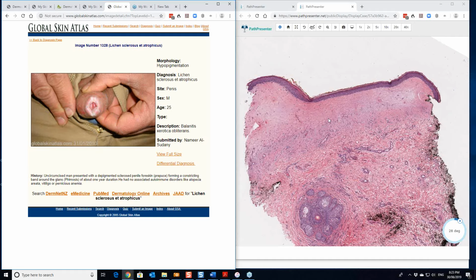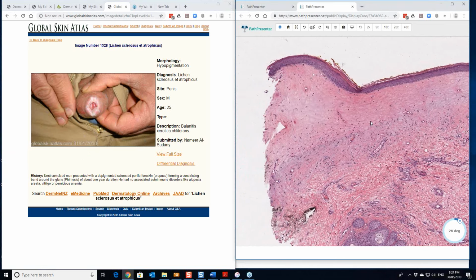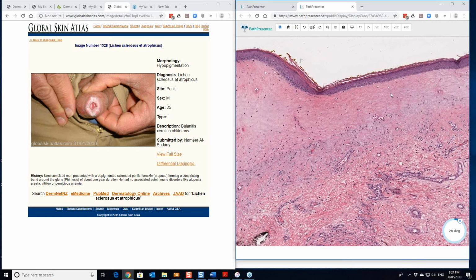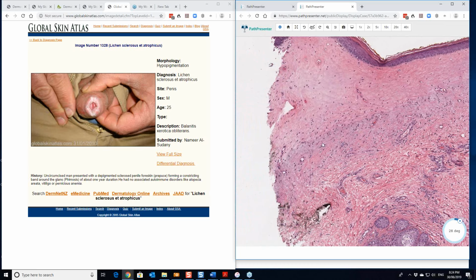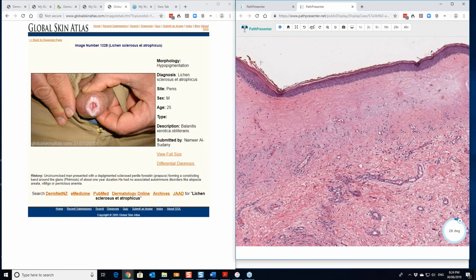Now, this is the histology over here. And we talked of the life of lesions before. This is a fairly chronic one. There doesn't appear to be much happening at the dermo-epidermal junction, but look at all this collagen laid down here. So you've got this thick band of collagen, and then you've got your lymphocytic infiltrate in this area here. It's a very sparse one too.